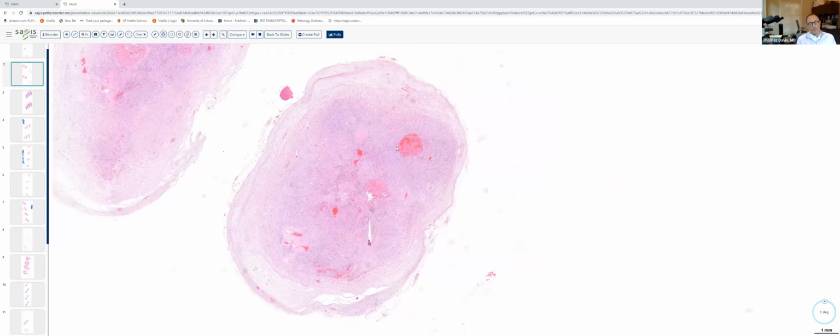Schwannomas are peripheral nerve sheath tumors, much as neurofibromas are. These are almost always located in the subcutaneous tissue, and it's important to keep in mind that these are a pretty heterogeneous group of tumors in that no two schwannomas are going to look alike. The Antoni A and Antoni B tissue are not uniformly distributed throughout the tumor. So the amount of each type of tissue varies from schwannoma to schwannoma, and even within a given schwannoma.